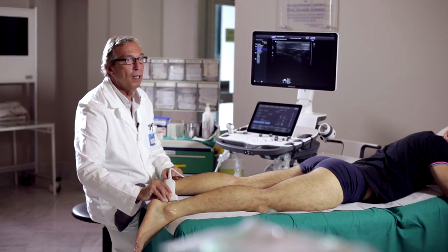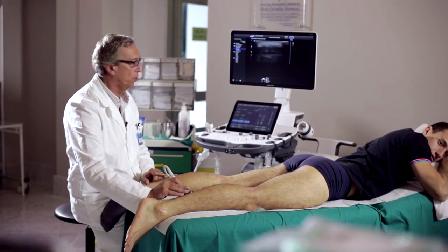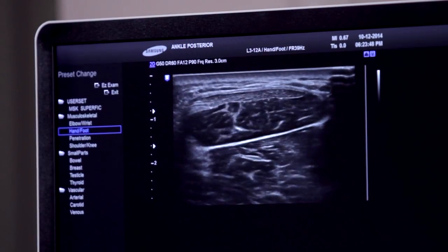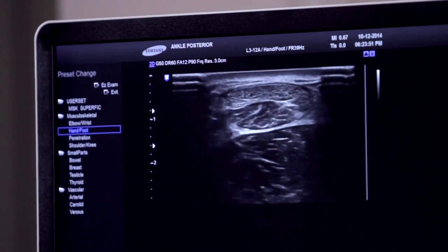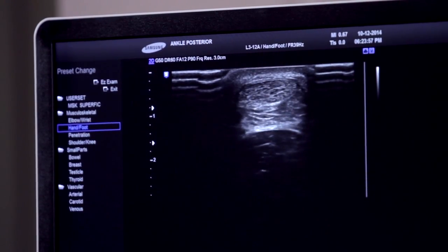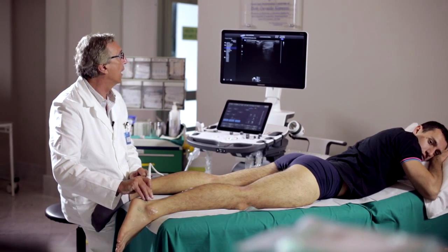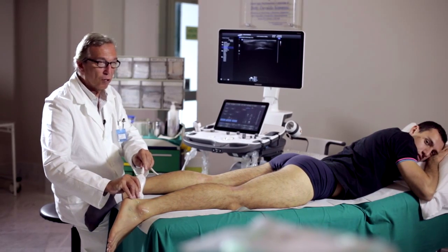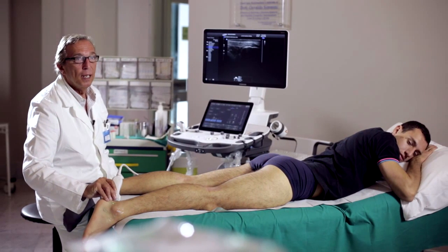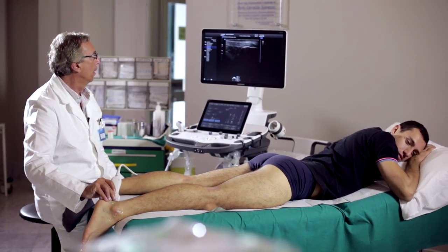Another important scan is the one along the minor axis of the tendon, from the proximal myotendinous junction, which is part of the gastrocnemius, to reach the tendinous structure. We have to focus in the scan to keep the orientation orthogonal, to avoid artifacts related to anisotropy. I would still like to remember that at the level of this insertion there's a small bursa, the retrocalcaneal bursa, which obviously can be studied only when it is distended by fluid.